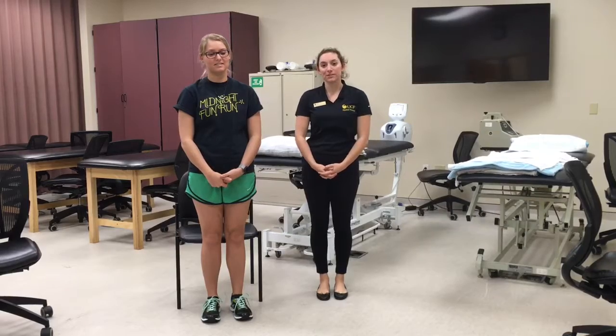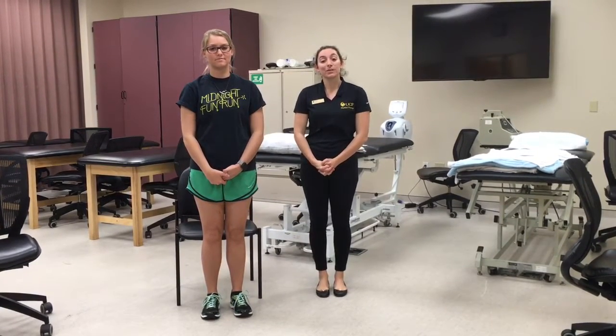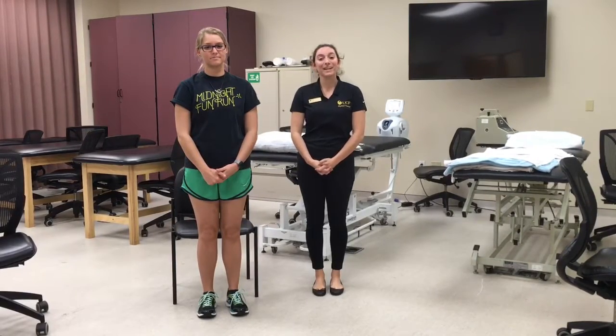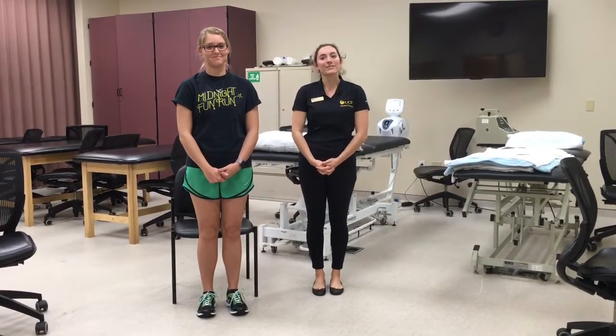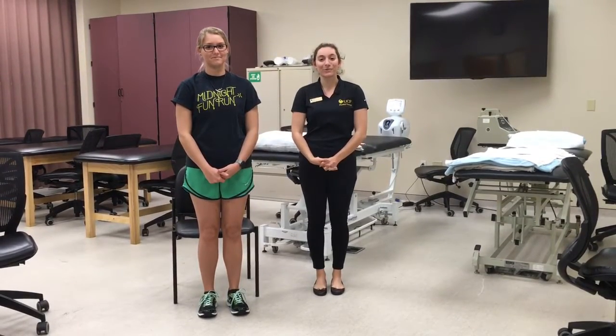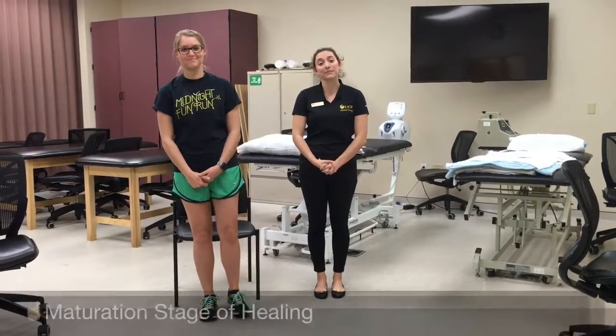My name is Sabrina Viola and I'm a first year student at the University of Central Florida DPT. Today I'm going to be showing you how to apply thermotherapy to a patient. Today my patient is a 65-year-old woman named Olivia who has a five-year history of type 2 diabetes and a stage 3 ulcer on the plantar aspect of her left foot. It has been present for three months.